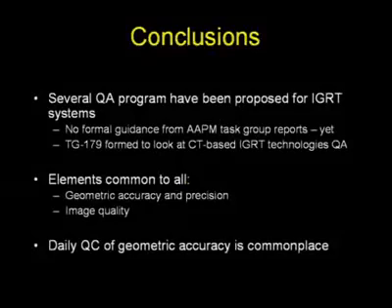So to conclude, QA programs have been proposed. They focus on geometric accuracy and image quality. And I will stop at this time.